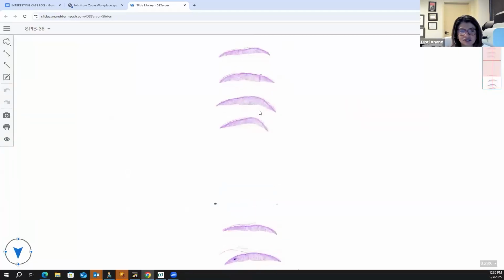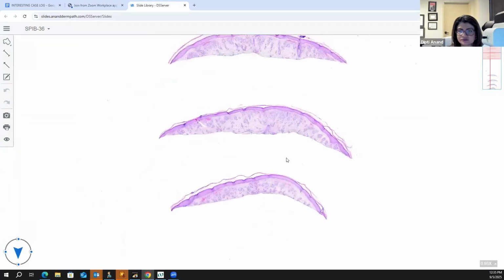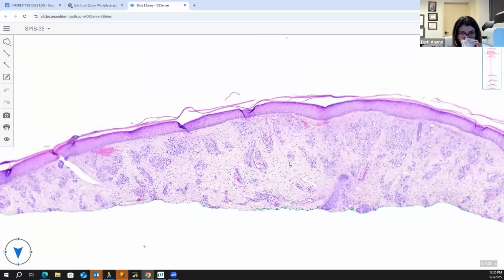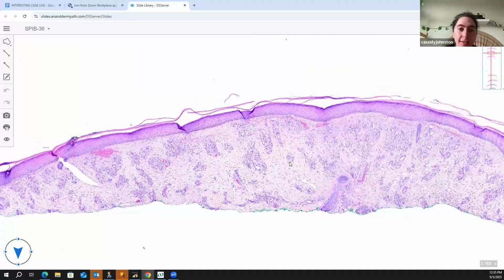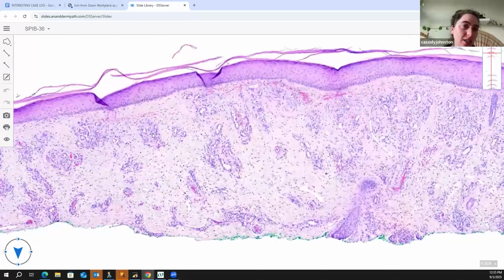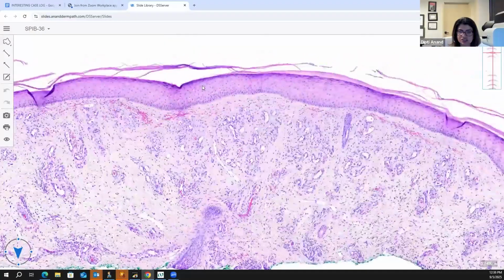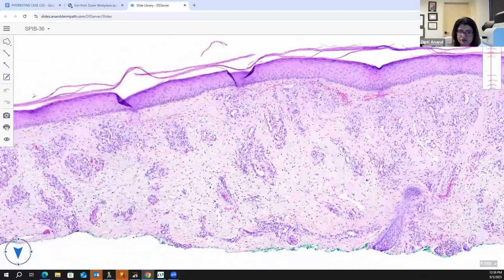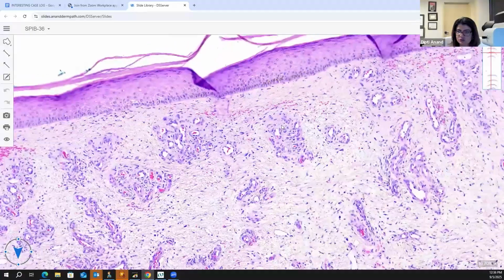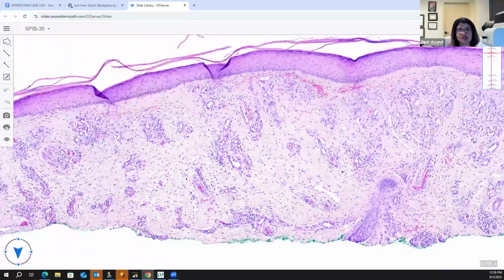So that's good. 36. I can take it. I thought we had some atrophy in the epidermis and then tons and tons of vessels that we'd call cannonball vessels. So I thought this was stasis. Yeah, but this is really classic for stasis where you have a thick epidermis, you have fibrosis, and you have this lobulated proliferation of small size thick wall blood vessels with hemorrhage. But this is very classic for stasis.